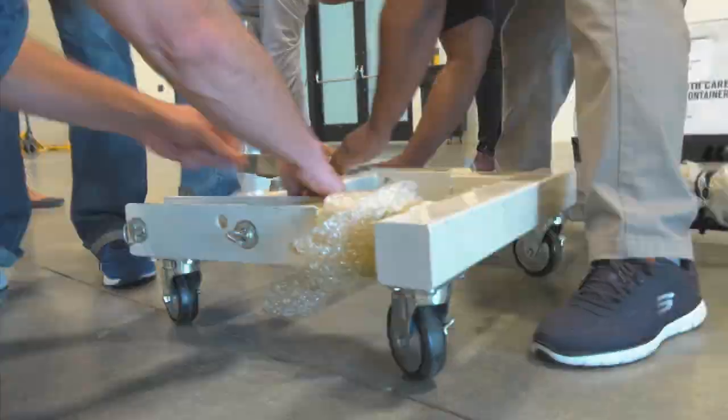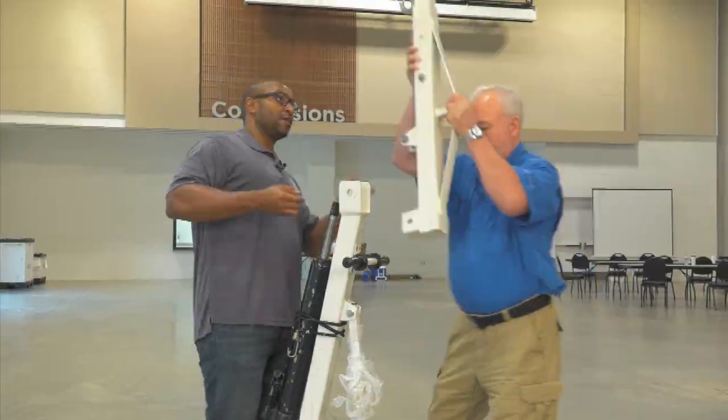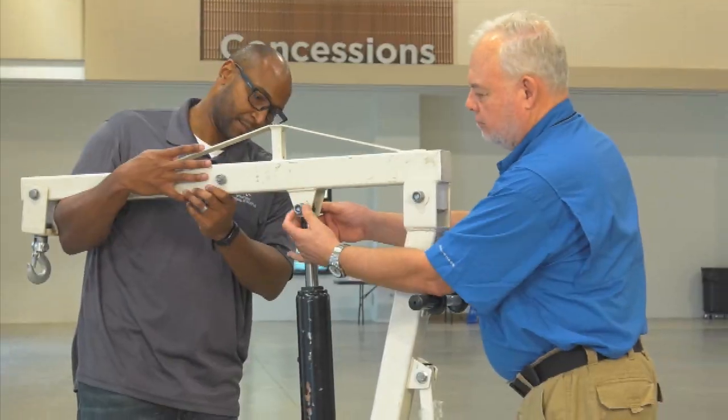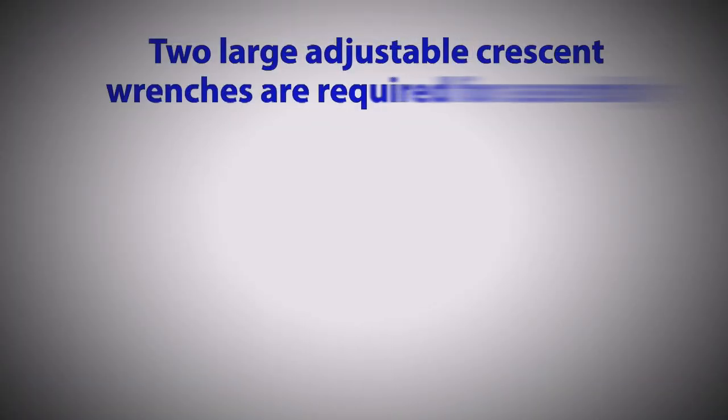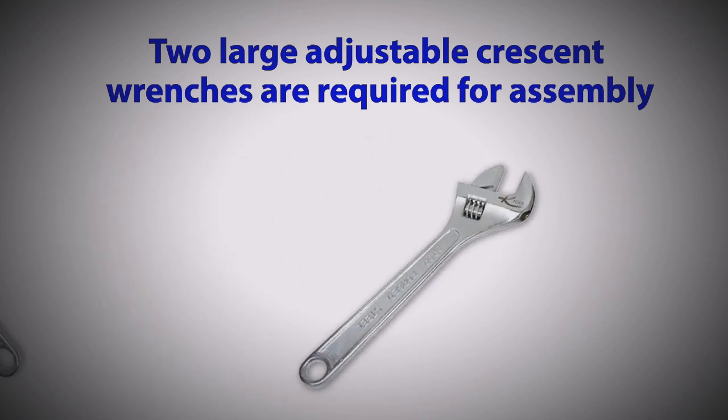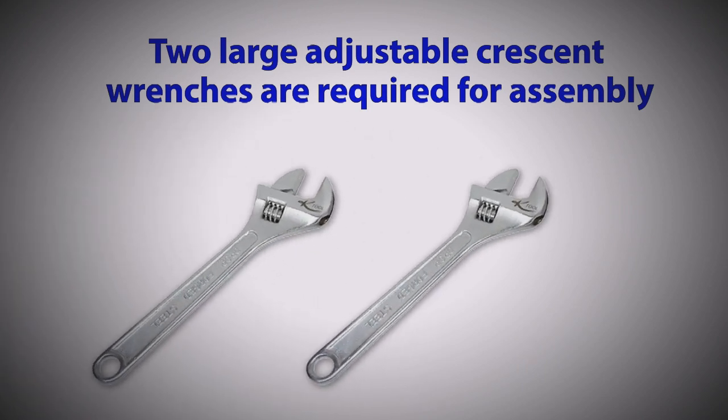Like the bariatric bed, assembling the lift can appear a bit intimidating. However, if you follow these steps, you will find it quite simple. Please note that in order to assemble this unit, you will need two large adjustable crescent wrenches. These are not included in the set.